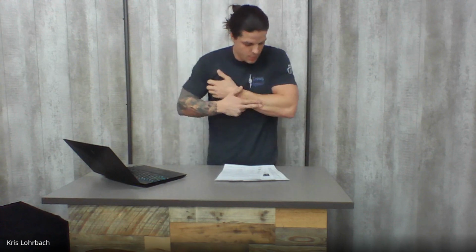So general goals we have are achieving a stable sitting posture, maximizing contact area of the skin to minimize pressure, optimizing friction for stability without excessive shear. And shear is literally this. When you have something that presses against your skin and then pulls it. And you can prevent that with all different kinds of materials that cushions and cushion covers are made of. And we'll get into that a little bit later. Controlling heat and moisture with adequate ventilation. There's a lot of different technologies that do that. Correcting postural issues if possible.